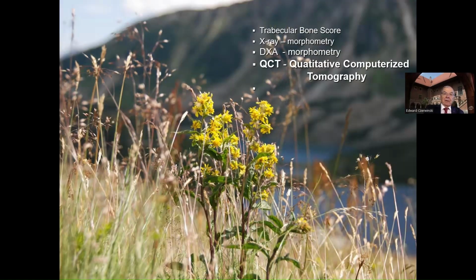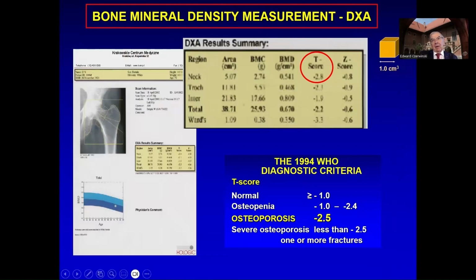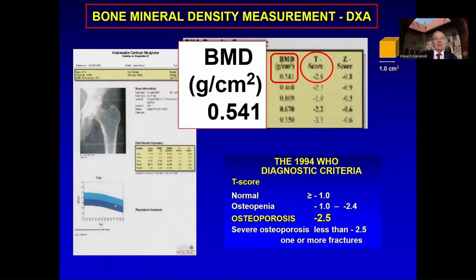Right. So this was the fracture detection, but we are really interested in the structure. DEXA gives us just the measurement, so we know the diagnosis, and I told you in the previous lecture to take care.